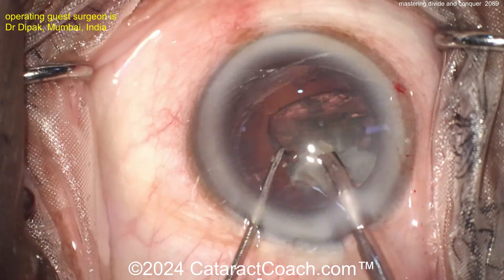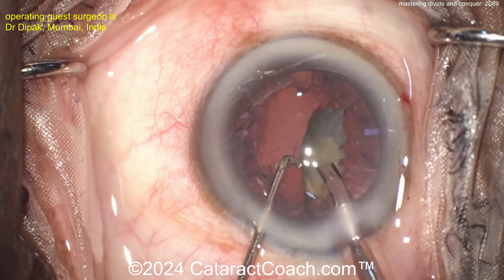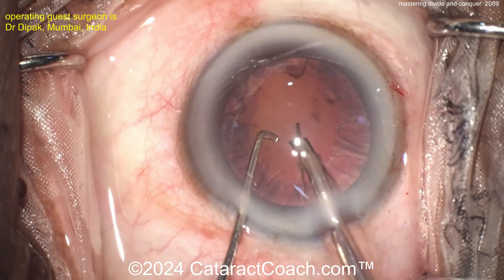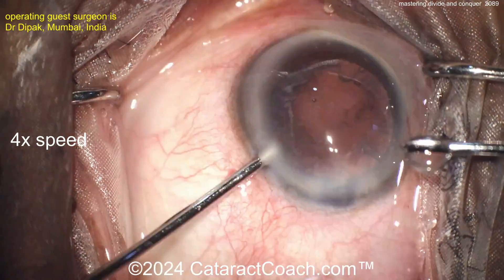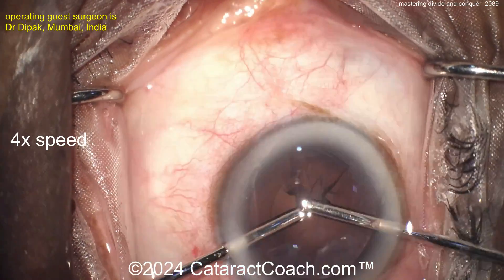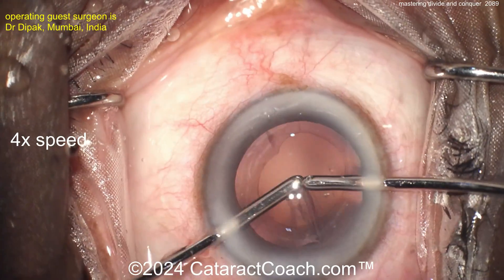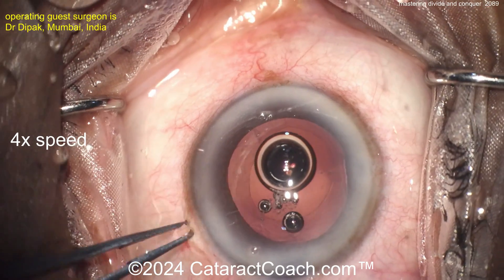This is a good move: learn divide and conquer and then go to stop and chop. End of the case — last little bit of nucleus coming up. Be careful you don't want the posterior capsule to come up towards the phaco tip. The rest of the case is routine: a little cortex cleanup. I like the bimanual setup — very nicely done. Switching hands with the bimanual, going to the other side — nicely cleaned up. We can judge the rhexis size at the end once you get the IOL well in the capsular bag.